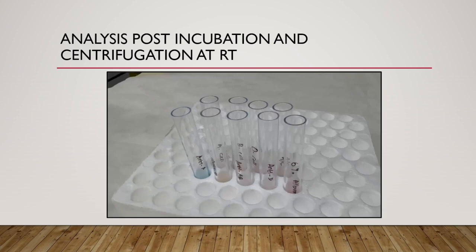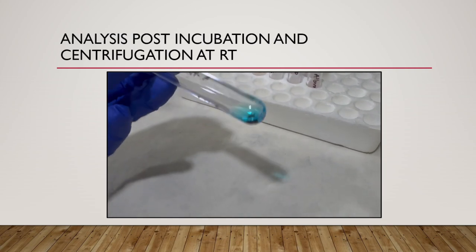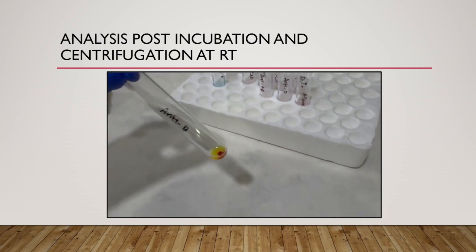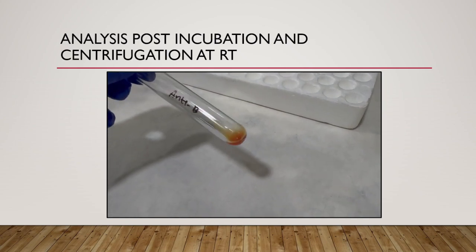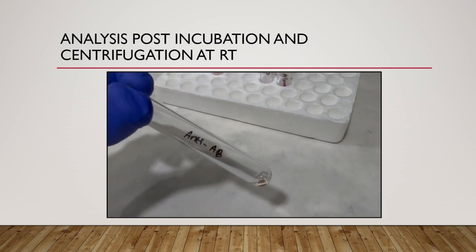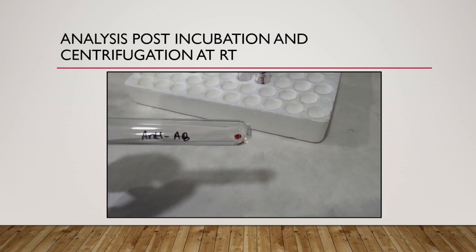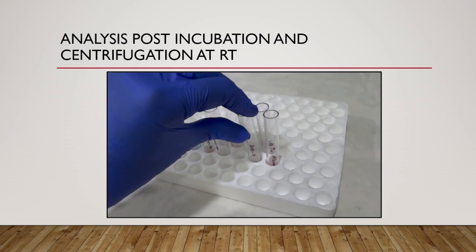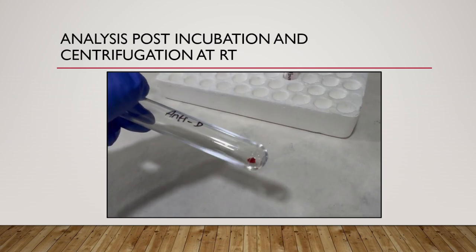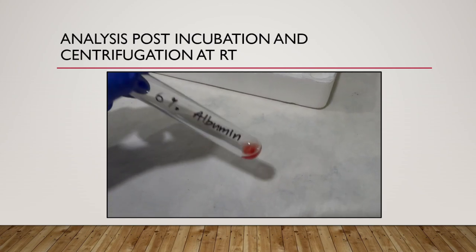Now coming to analysis after incubation at room temperature followed by centrifugation. First we will be seeing the tubes of forward grouping. In anti-A we can see that there is a strong 4 plus agglutination reaction. In anti-B, while gently shaking the tube, we can see there is no agglutination reaction. In anti-AB also there is a strong 4 plus agglutination. In anti-D there is a strong 4 plus agglutination reaction. In the control tube of 6% albumin there is no reaction.